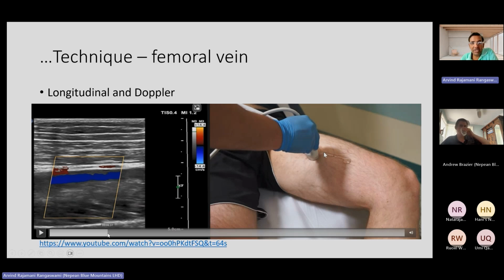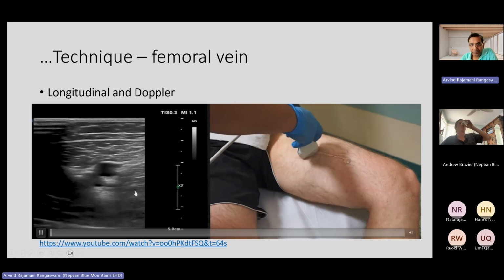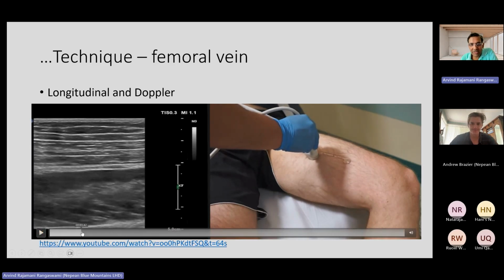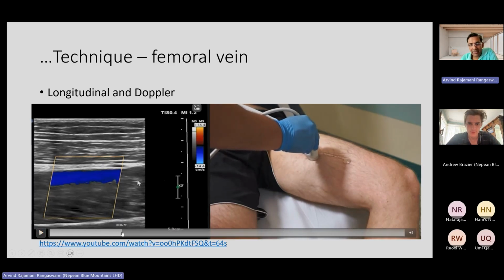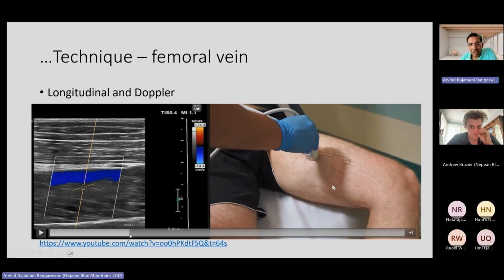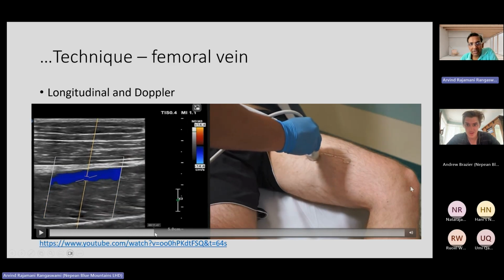It can still measure the flow to some extent. So that's why it is important for you to make sure that you choose the vascular setting. So you apply, you get the color Doppler, then you put pulse wave Doppler.